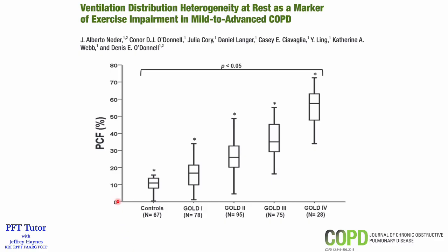So as you can see here, you have the PCF percentage on the y-axis and controls. The difference between the TLC and the VA is not very large at all. But as their GOLD stage increases, you can see in a stepwise fashion that the PCF increases with it.